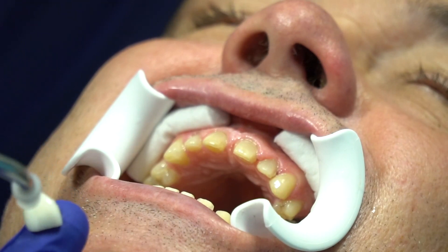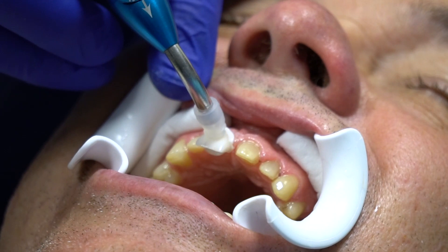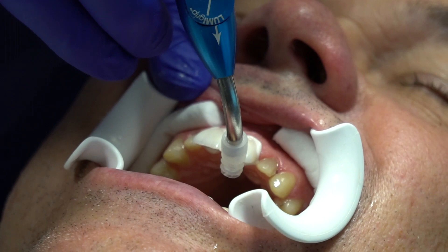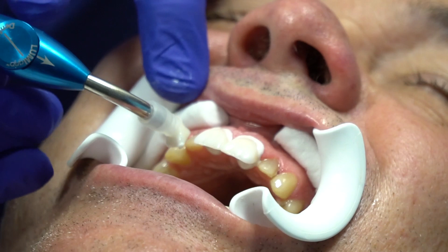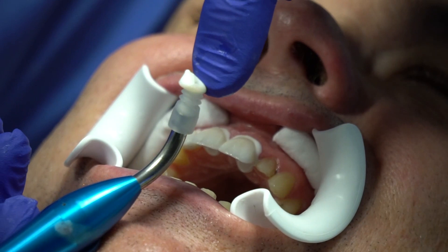We're going to seat this on — number eight, nine, seven. We just go ahead and seat them, checking in. Make sure we've got all the resin in there. When I picked it up off your finger it moved off the right incisal — make sure it's fully seated.